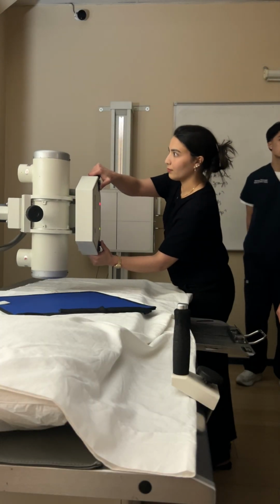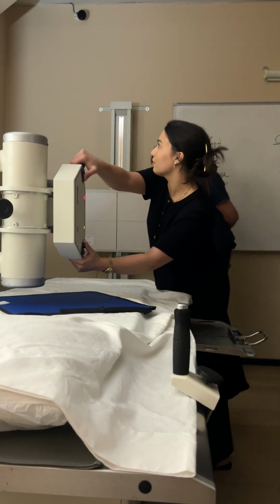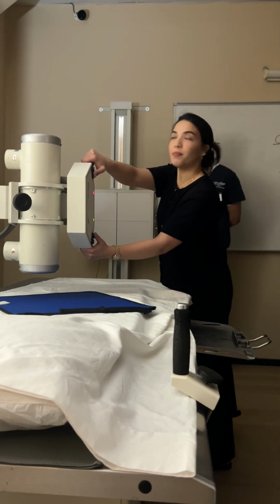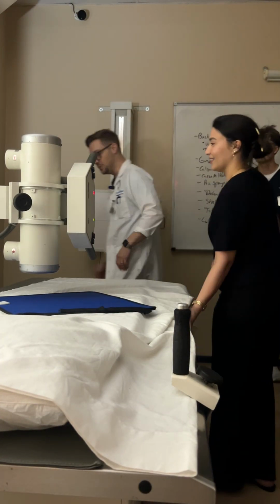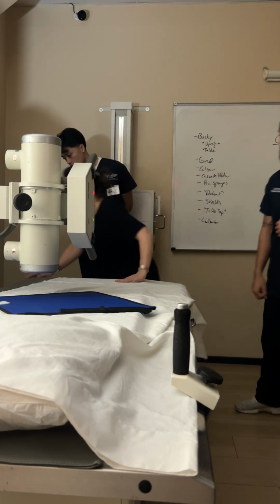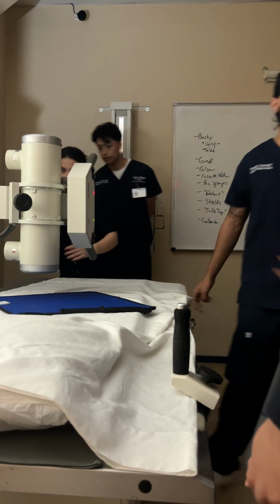Okay. That's an oblique hand or finger sponge. Let me show you where 72 is. So right here, there's a super high-tech piece of electrical tape. Cool. This is 72 inches.